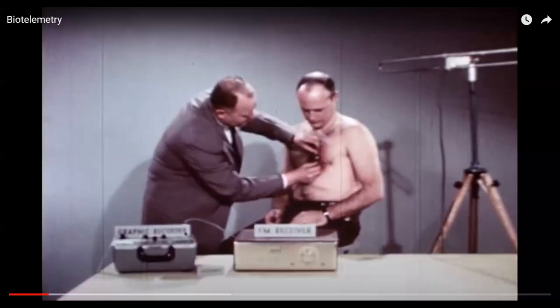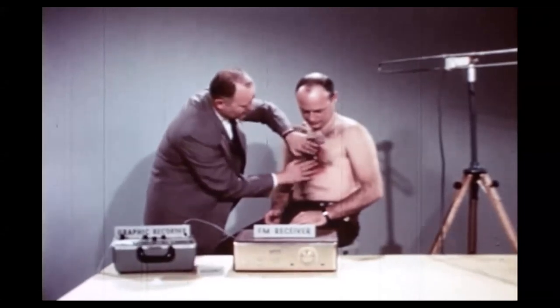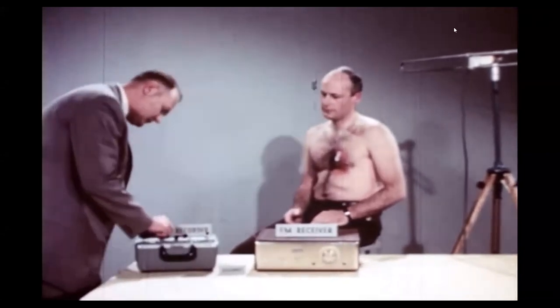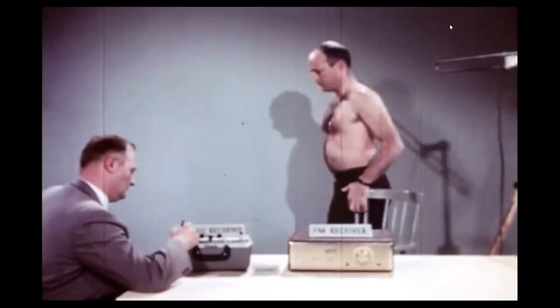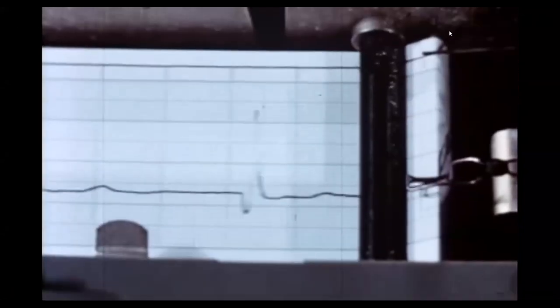Astronaut monitoring led to the development of monitoring devices such as the wireless electrocardiogram monitor. A small transmitter placed on the chest is designed to transmit heart signals to an FM receiver. Even while a subject moves around, his heart signals can be transmitted continually. The great advantage of the system is that it permits instant visual readout and analysis.